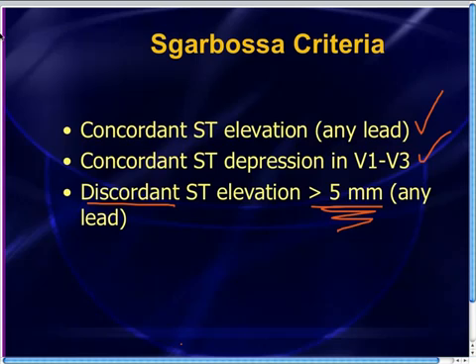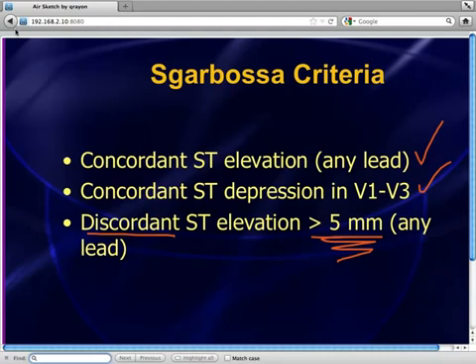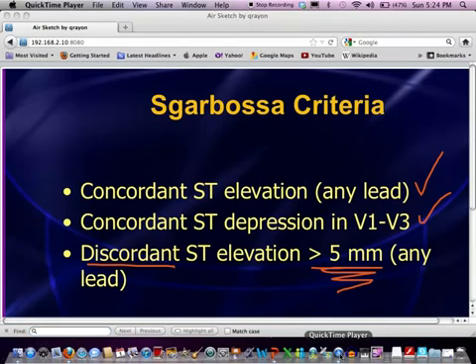And I think there's reasonable evidence now to say that you can go ahead and thrombolyze that patient or send that patient to the cath lab. All right, so pacemaker in the presence of acute infarction in the presence of a left bundle branch block pattern. Yes, you can make some conclusions about ischemia or infarction in contrast to the traditional teaching.